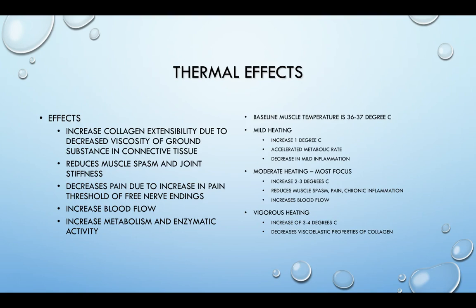Poorly vascularized tissue is going to increase more than highly vascularized because the blood vessels are going to remove the heat. So again, that's the difference between like muscle and tendon. Again, if we have standing waves, we're going to get more heating. So superficial bone is going to heat up faster as well. So we have to take that into account while we think about this too.